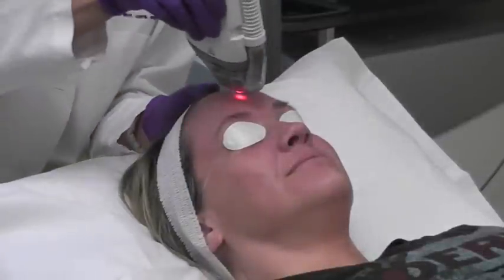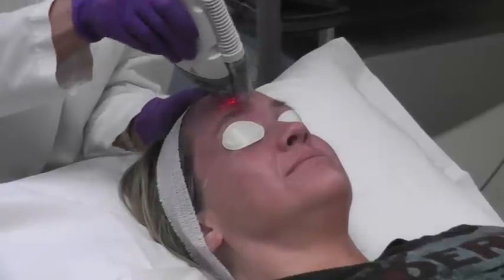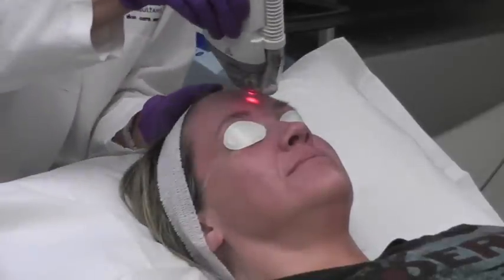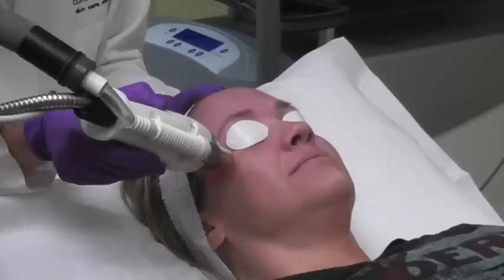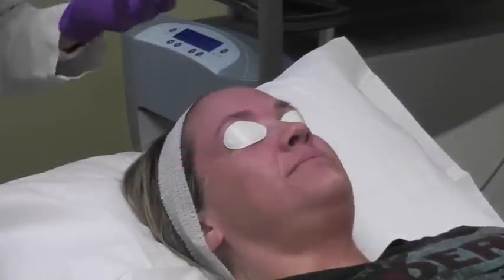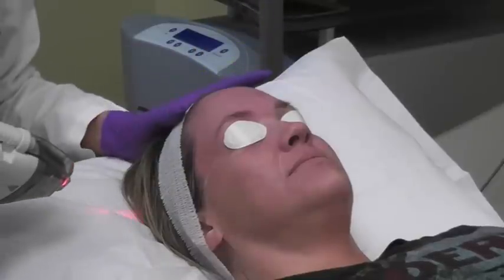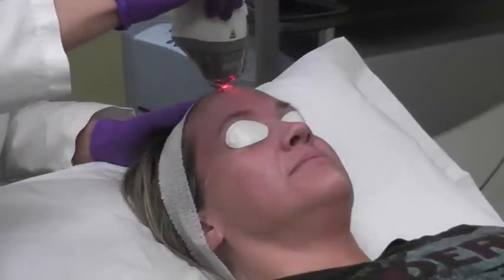What this laser is doing right now is basically going through the top layer of skin and targeting the middle part of the skin called the dermis. As that comes and peels, we're going to get this wonderful, wonderful glowing look to your skin. It's going to be absolutely fabulous.